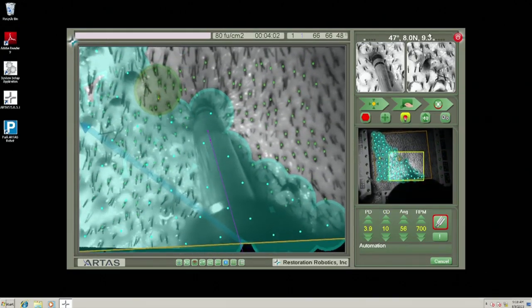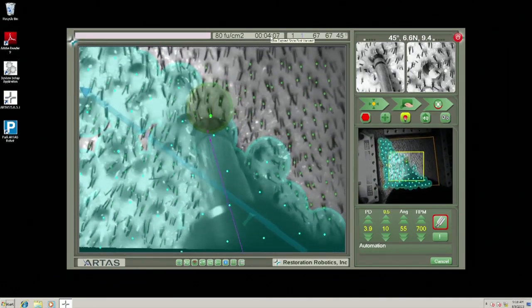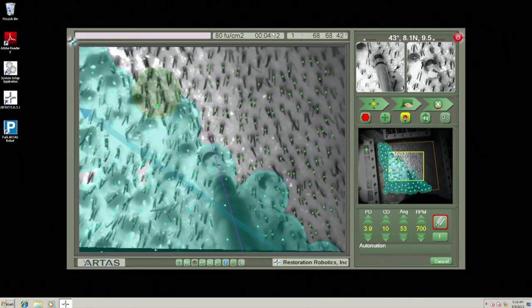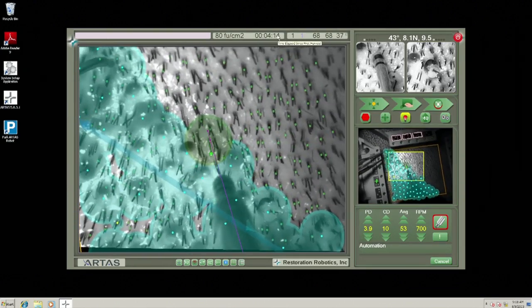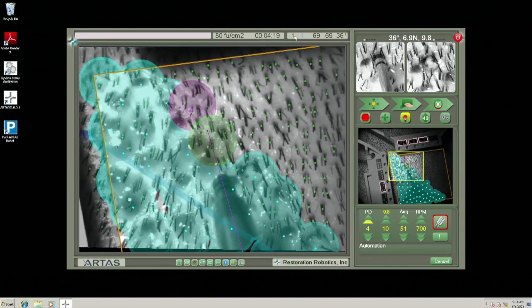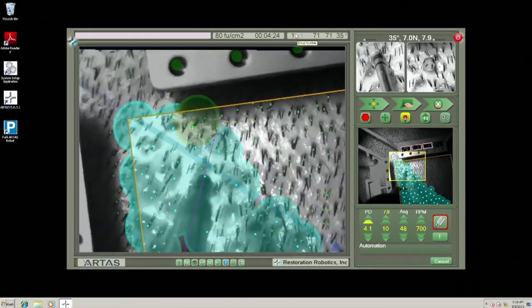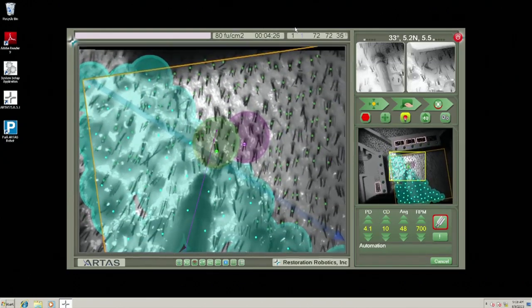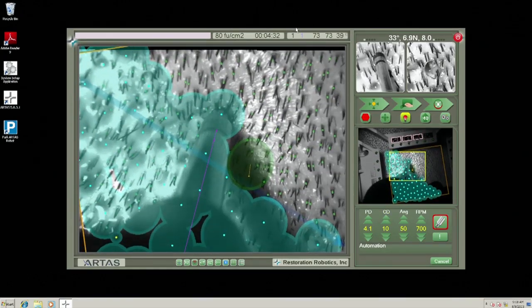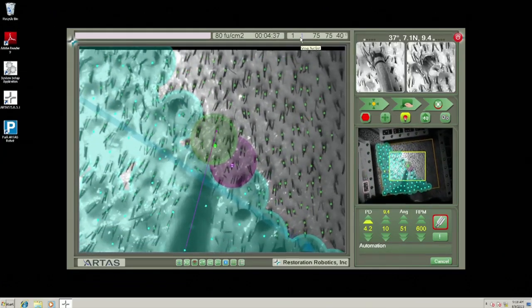Correct. And now I'll introduce you guys a little bit more to the interface here. You can see the elapsed time up here for dissection. That way, when we're done today, we don't have to look at all of these and be aware of them in real time. It's being recorded, and a PDF file of approximately 4 pages of different metrics can be populated at the conclusion of the case that tells you about the many different things, like the average dissection depth, all kinds of things that you can follow, and if you want to study them in your practice, you have the ability to populate those reports routinely.